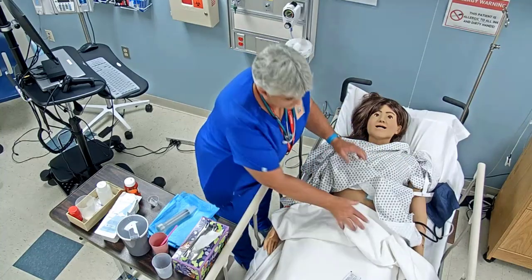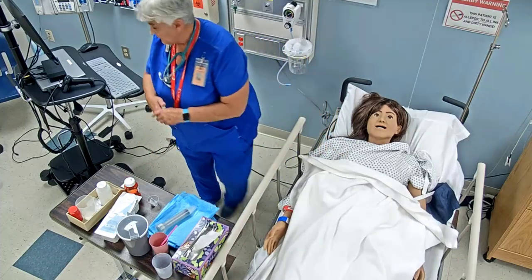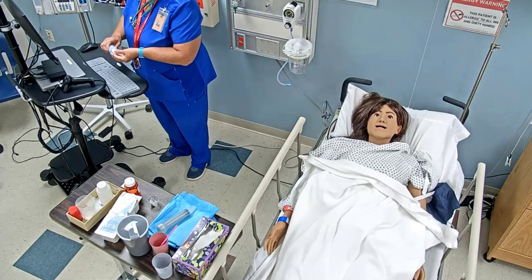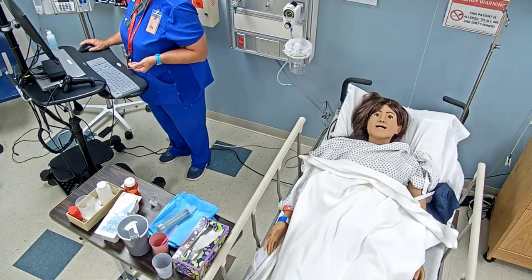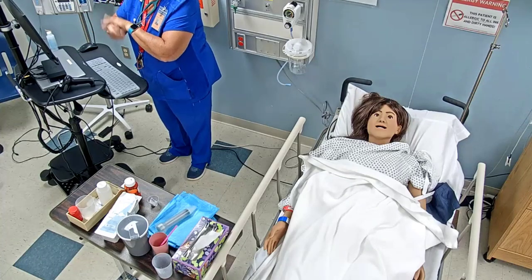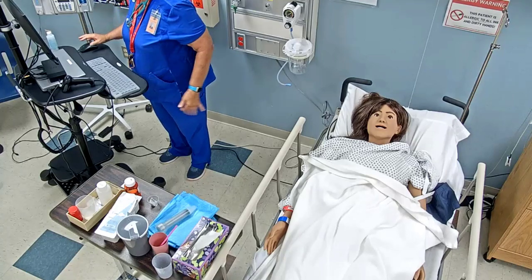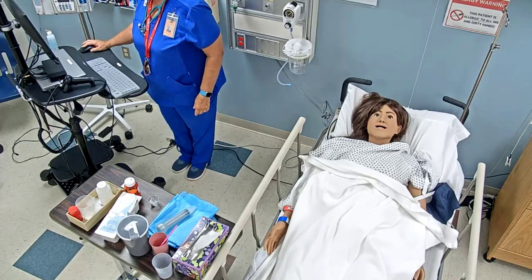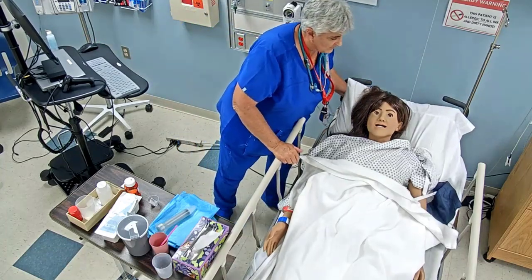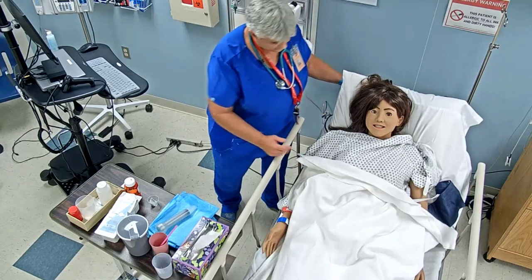So I'm going to go ahead and cover you up real quick, and let me do a medical hand wash real quick. And let me just check my chart here. Okay, so 118 over 78 and 84. I don't want to leave you at that, so I'm going to bring you back up to a 30 to 45 degree angle, okay?